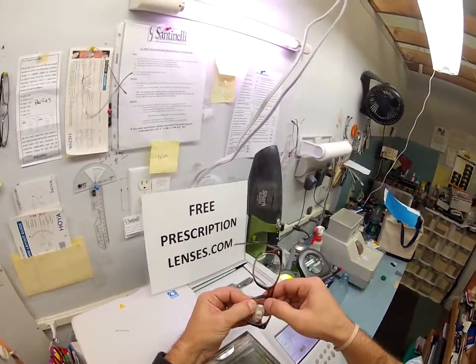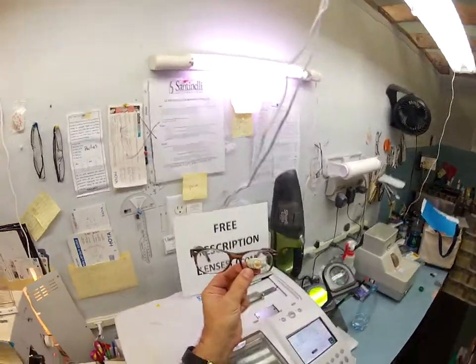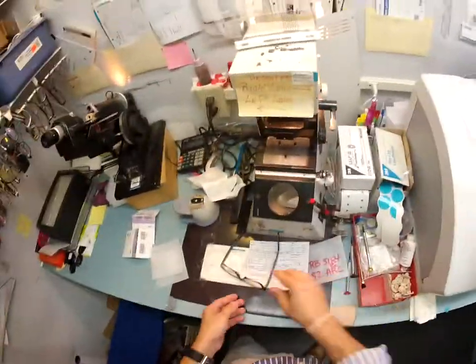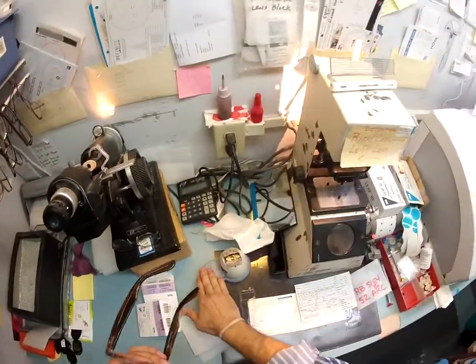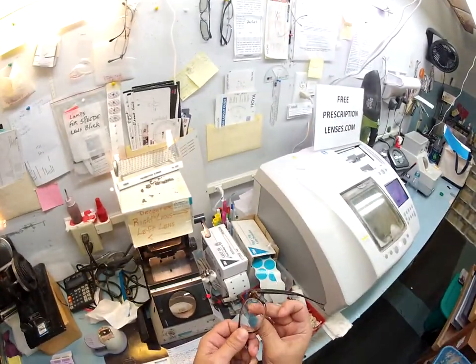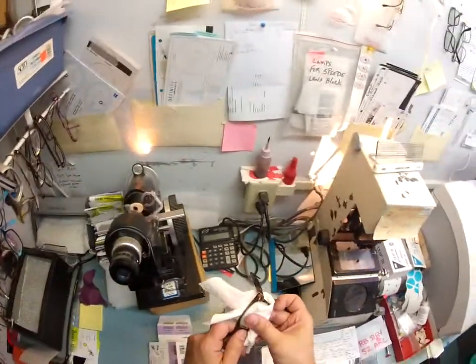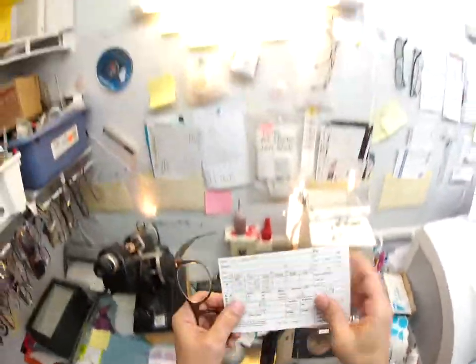Tuck it in at the outside corner, then using the thumbs. Look at that, it snaps in this time, so I'm going to take this block off. I can almost do that with the anti-glare coating because it makes it a little bit more slippery. Normally, I'd have to use this tool to pull it off. So I'm going to pull this sticker off. Again, I'm so strong, I can do this by hand. I'm going to dry everything off again. I do want to inspect.